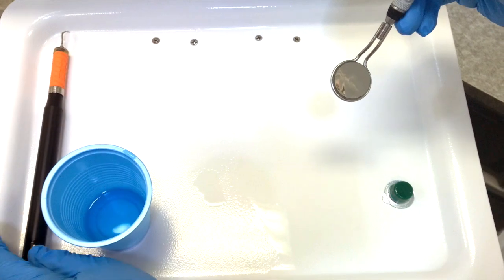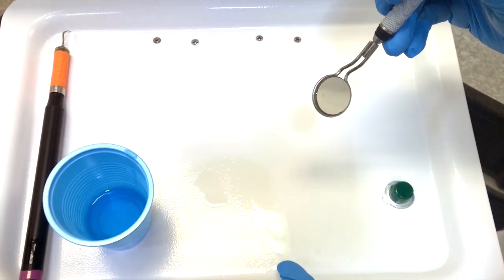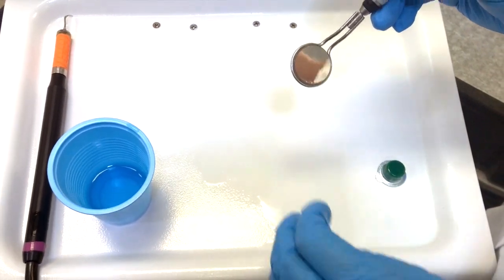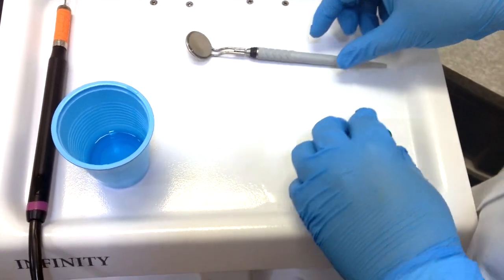The second way you can do is you can actually use a little bit of prophy paste on your mirror to help prevent the dots.